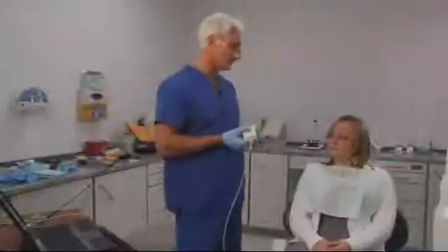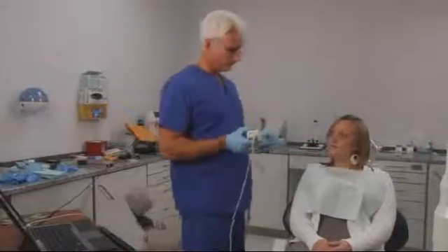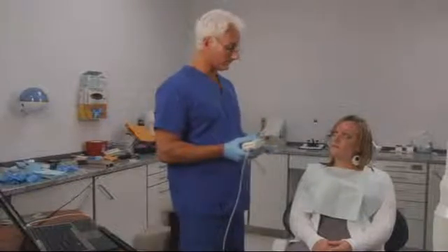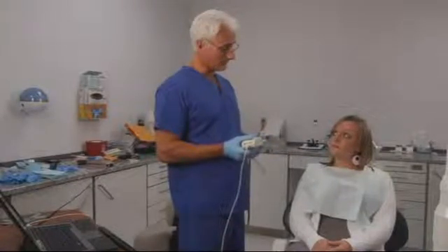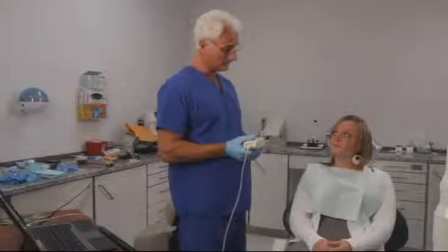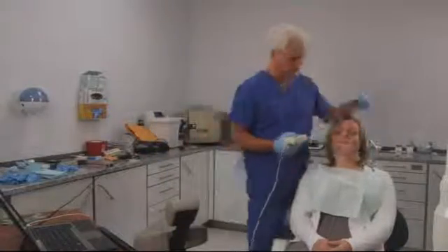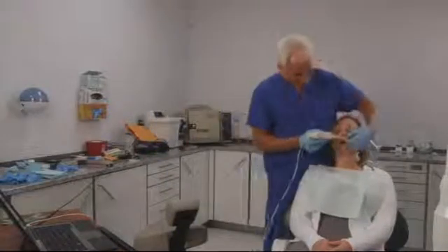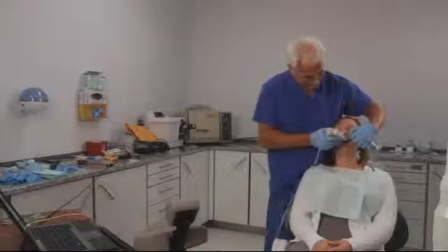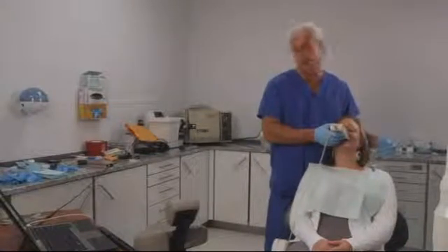Okay, so now we're going to record your three excursions — right, left and protrusion. We're going to do the right one first. I'm going to have you bite down through the sensor, hold your teeth together, and then slide to the right. Put your head back for me. And each time, before I record, I'm going to have you close fully into the sensor to make sure you're seating your bite correctly.